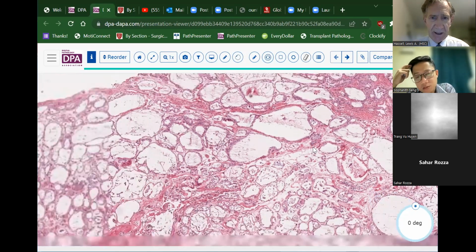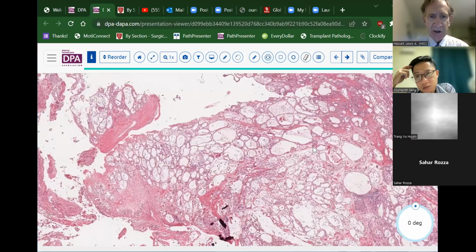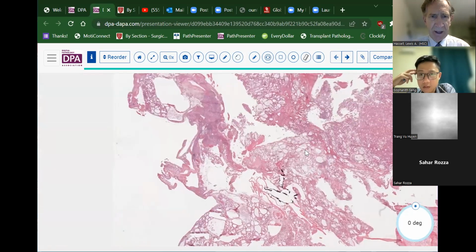And so we can see papillary carcinomas, or even occasionally undifferentiated carcinomas or poorly differentiated carcinomas that arise from a stroma ovarii. So those are the learning points, I think, from this particular case, is just to remember to think about that possibility, and you should be good.